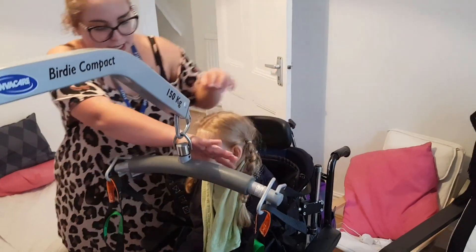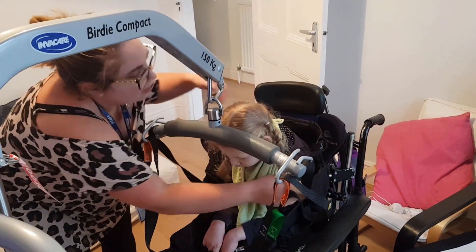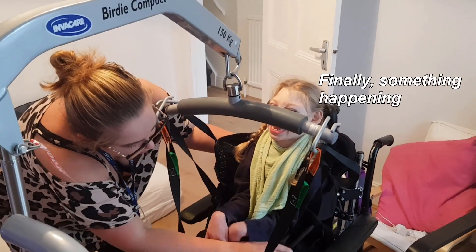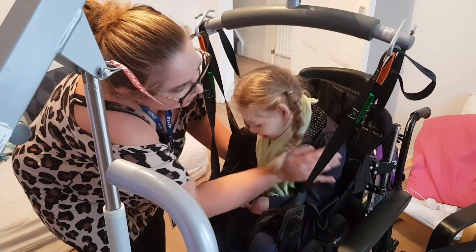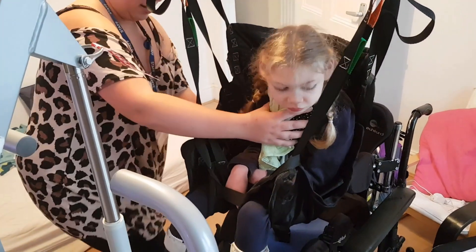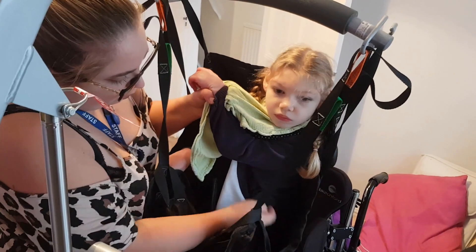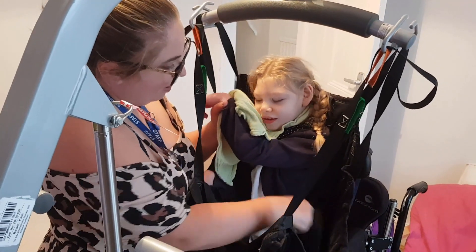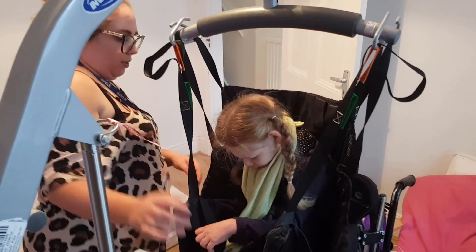In a minute mommy's going to send you up — just double check that you're all in. Up, up, up, up — check the tubes out — all the way. I can see the need for that strap, definitely. So that will just secure her, and we will use that one then.